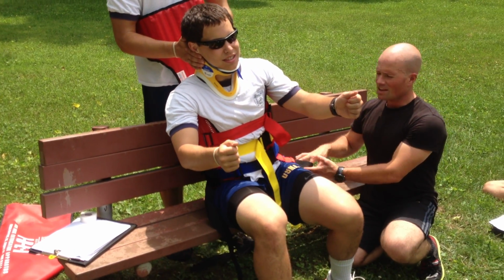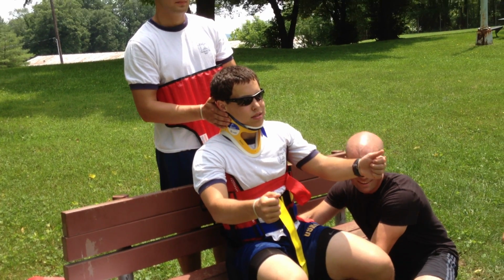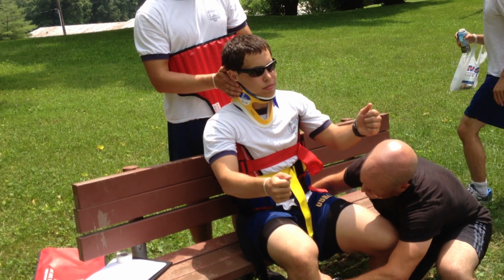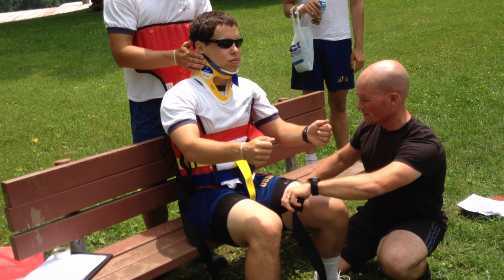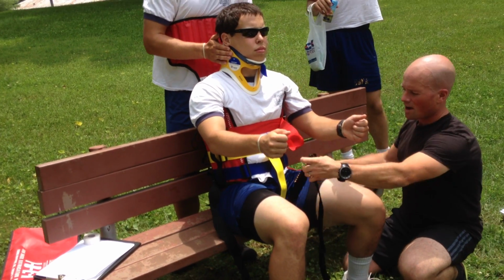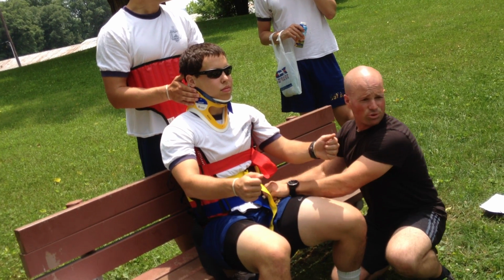That's all I need. I don't want the patient leaning so far that it's flexing the spine around. But now I'm going to floss. Really nice. A little bit more flossing. I made the group, you saw that? Oh, no. All right, sir, you can center yourself. I pull the tension from behind the butt cheek. I wrap around uncomfortably close. I buckle. And I do a little push and pull.